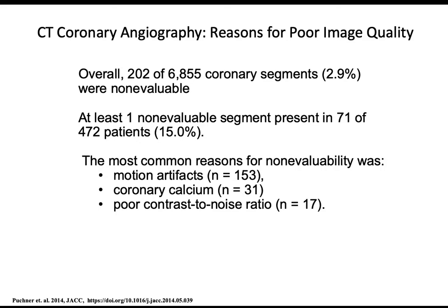However, how you do that is a challenge: you would have to take 5 pictures and hope the heart is in the same spot every time. I think we're going to hear about the dual source, where one source is at one energy and the other is at the other, so you can get them at the same time. The last technological approach is that Philips has a detector that separates out the energies on the detection side. You separate out the signal of high energy photons from low energy photons, so it is instantaneously registered. This has more been a question of how vendors actually try to do it. But from a conceptual perspective, asking what the attenuation is as a function of energy might be the most promising way to do it.